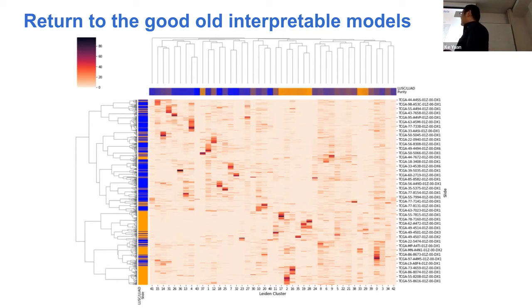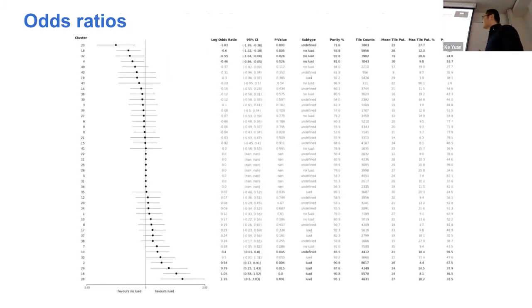Here you see concentrated clusters that are type specific, for example these ones, which are all orange. And not only are they type specific, some of them are also patient specific. This gave us hope that we may be able to capture patient specific information about morphology.